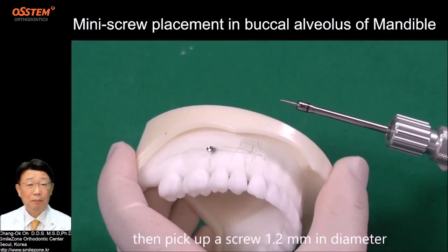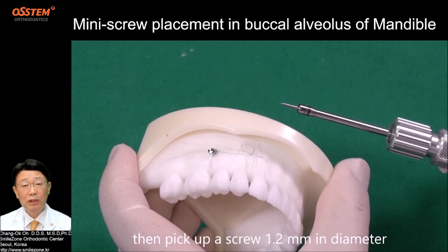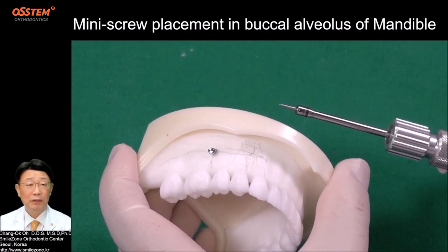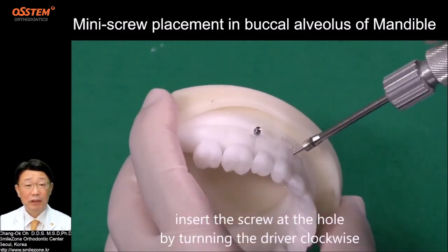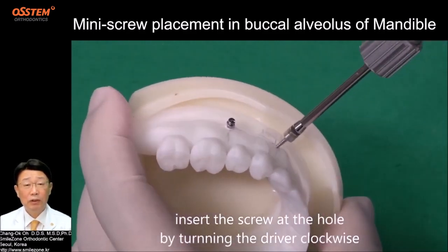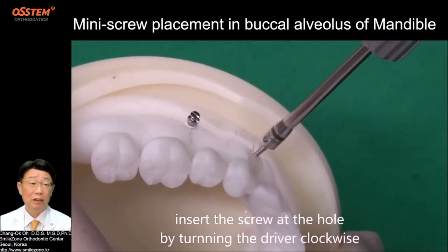Then pick up a 1.2 mm diameter screw and insert it at the hole by turning the driver clockwise.